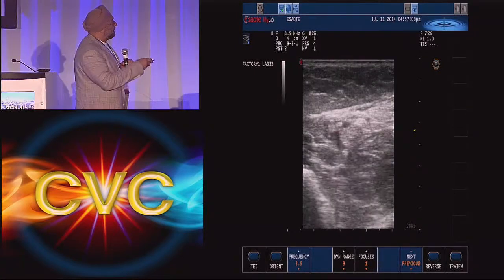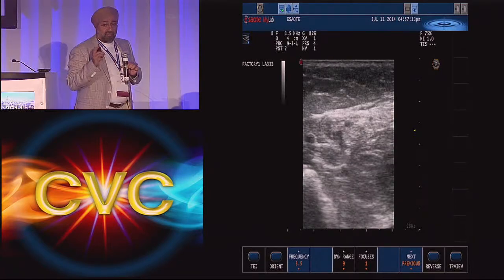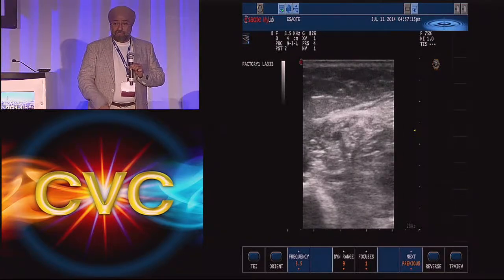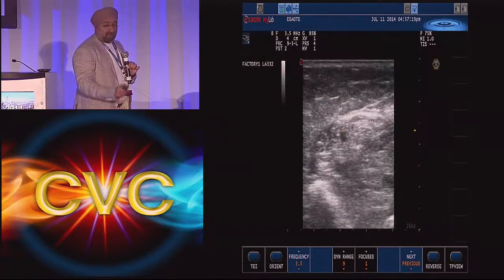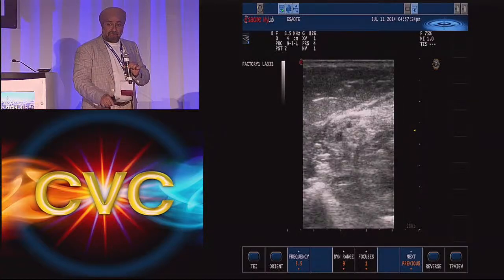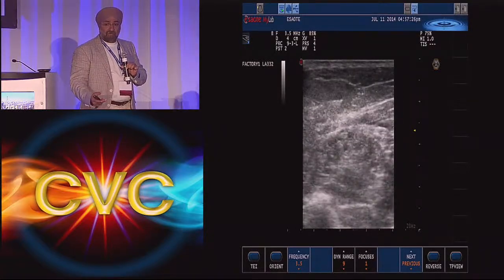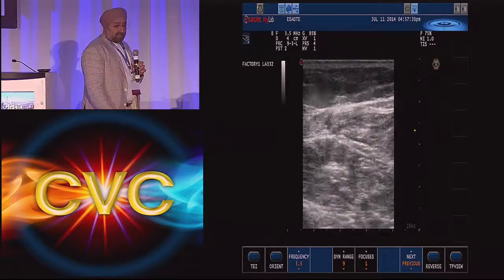So she's by the procedure table, and you start seeing perforators down there too. You have to remember that normally perforators at the ankle can be bidirectional, so it's not always abnormal. You have to correlate it to the symptoms, because if there's swelling in one part of the foot, follow that back and you may see a big perforator. How would you treat that perforator?